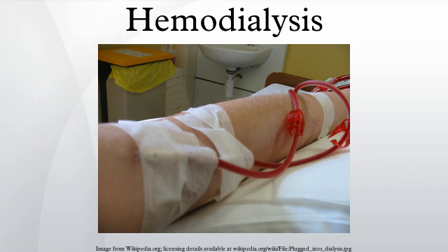One long-term complication of an AV fistula can be the development of an aneurysm, a bulging in the wall of the vein where it is weakened by the repeated insertion of needles over time. To a large extent, the risk of developing an aneurysm can be reduced by carefully rotating needle sites over the entire fistula, or using the buttonhole technique. Aneurysms may necessitate corrective surgery and may shorten the useful life of a fistula.